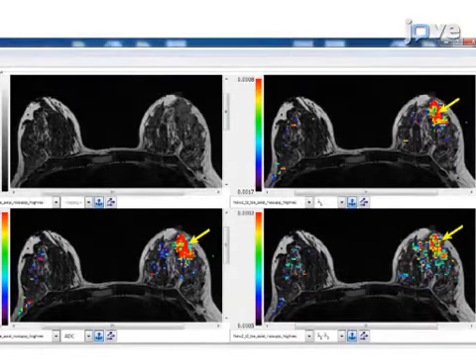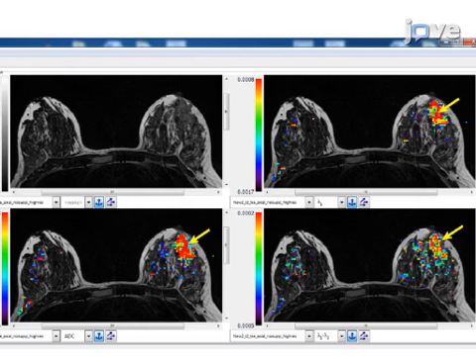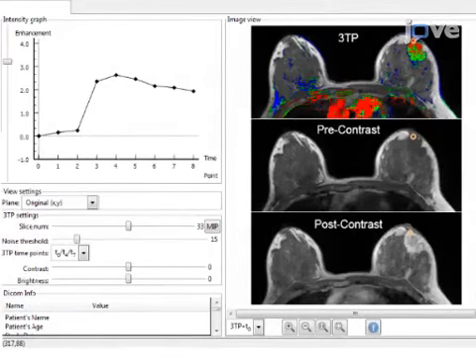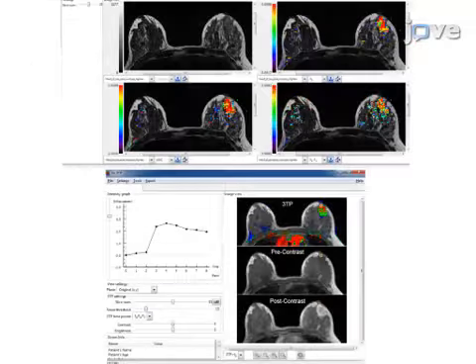The results show that the diffusion tensor parameters can reveal the breast architectural features and detect malignant growth by finding map regions with reduced diffusion coefficient values and reduced maximal anisotropy values compared to normal tissue. The new diffusion tensor imaging method showed a breast cancer diagnostic accuracy equivalent to the standard dynamic contrast enhanced 3-time point method.